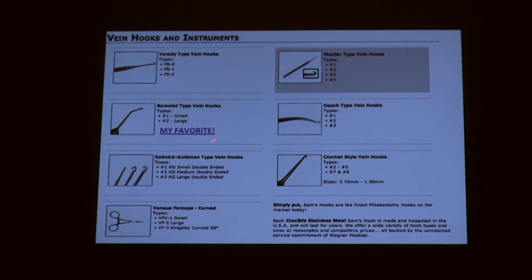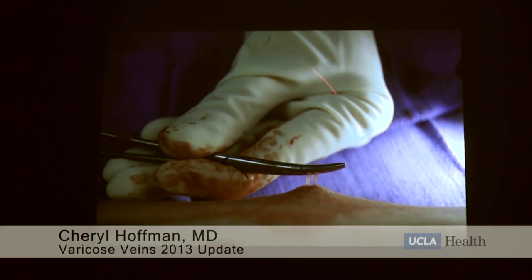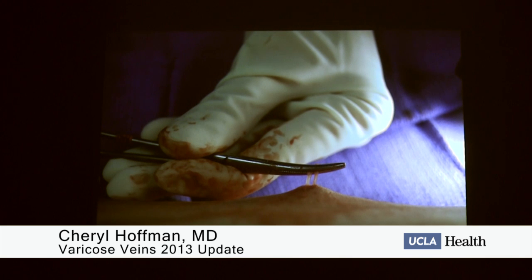These are the different types of hooks we use. I marked here, this is my favorite, but it doesn't matter, everybody has their own hook that they like. Whatever will get the job done is the bottom line. It is like fishing, and I fished. So I made a little hole here, I went down, I found the vein, I'm pulling it out, I grabbed it, I'm just gonna pull until it's gone.